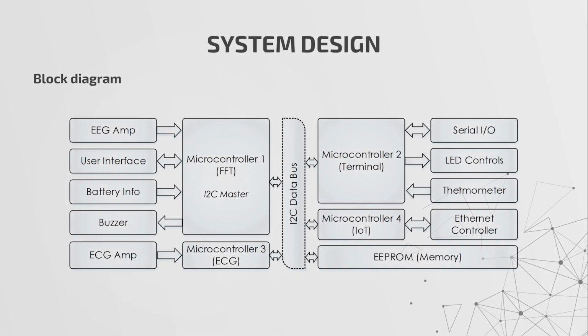It's a modular design. In this design, we have used a total of 4 8-bit microcontrollers to get the job done. Each microcontroller is interconnected through the I2C data bus so that they can communicate with each other when needed. There is an EEPROM chip used in this design to store MySQL database credentials and other system-level configurations. It's IoT enabled. This unit is equipped with an Ethernet controller, so it can be used as a MySQL client. That's why we can store biomedical related data into a central database in real time. We have used open source Arduino architecture to prepare its firmware.